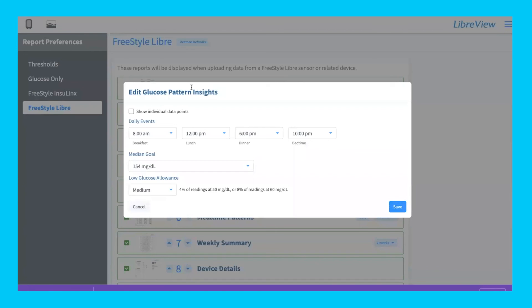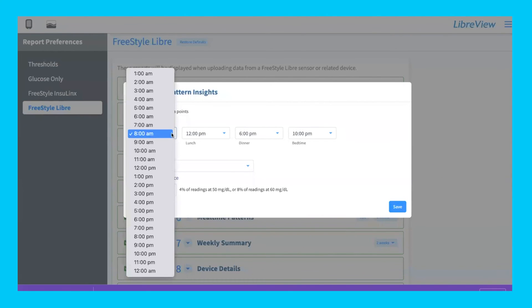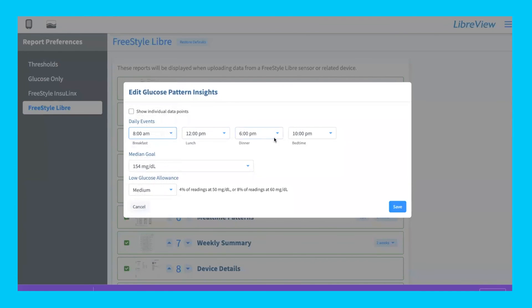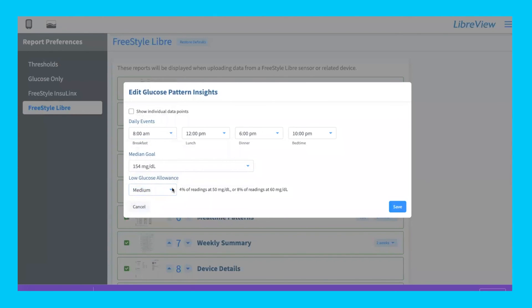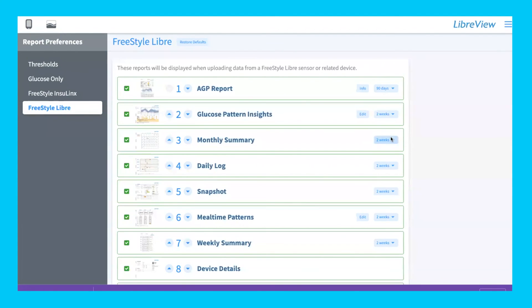For example, if you've just adjusted a medication, say you take a new medication in the morning, you can focus in on what your blood glucose levels are doing right after that medication and after breakfast. You can log exactly what times you want to look at, adjust what time your mealtimes are, and adjust your median goal — what you want your blood sugar to be on average — and your low glucose allowance. Once you save that, when you print the report, it'll show only the data you need rather than everything, which can be overwhelming.